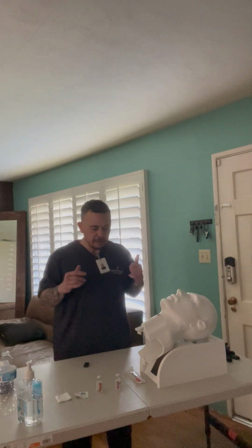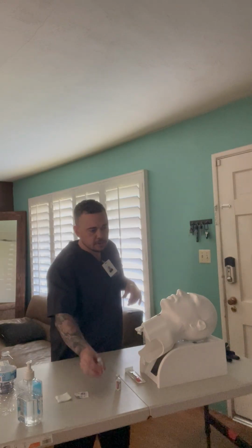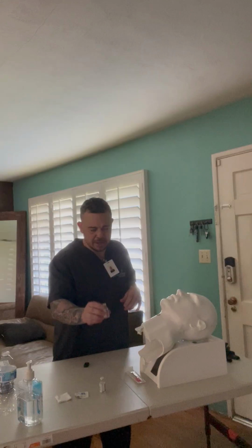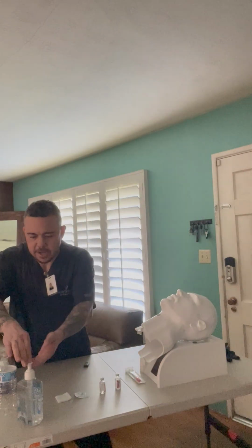I'm going to have another nurse come in and verify with me, along with the EHR and the MAR, that we have what we need, which is 4 units of the regular insulin and 8 units of the NPH, or intermediate insulin, which ends up being a total of 12 units of insulin. Okay, all right, thank you, nurse. I appreciate your help. Now once that's all said and done, I'm going to proceed.